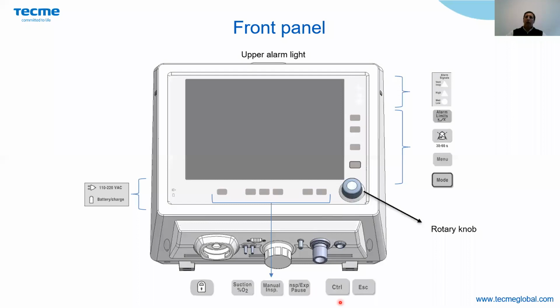Then control and escape keys, which have other functions. For example, control in order to set the sensitivity more precisely, and escape in order to cancel and go into the home screen.